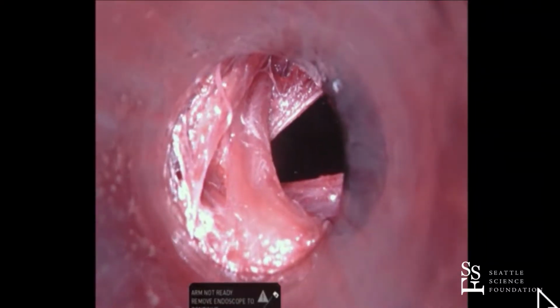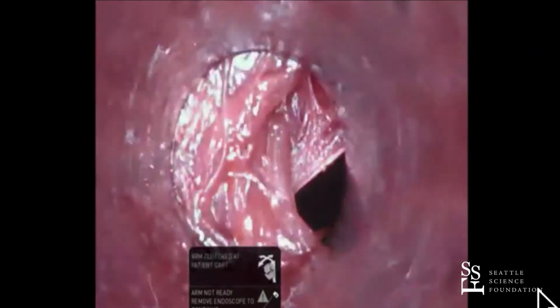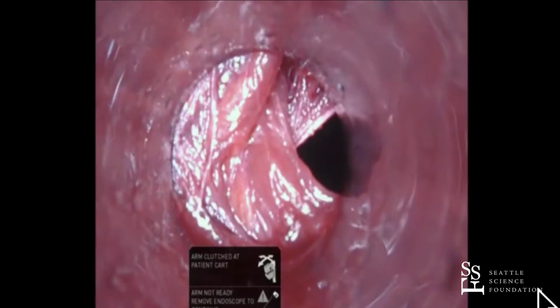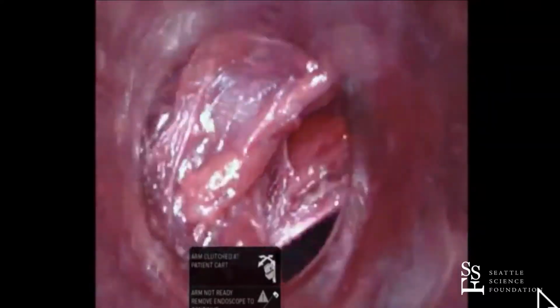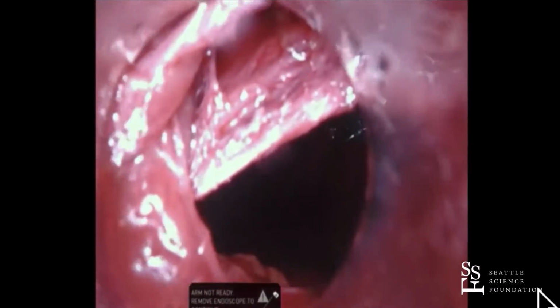Oops, that port's out too. Yeah, I think having this pre-ischemia checklist is important. There are people who actually put something on the wall. Unless you work with the exact same team every time and everyone knows exactly what you're doing, which is a real luxury, you ought to have something written down that everyone can follow.